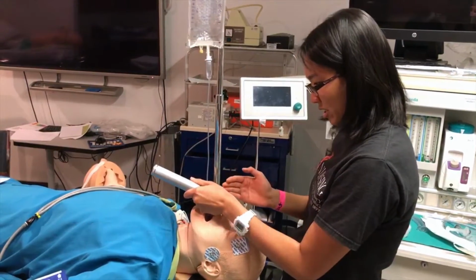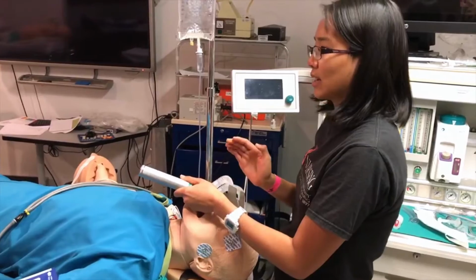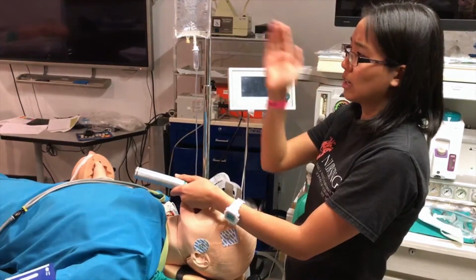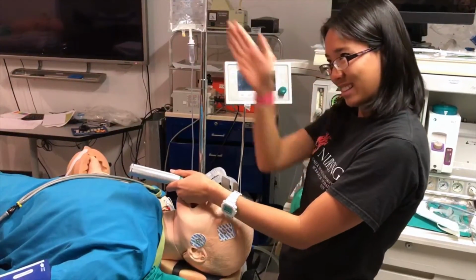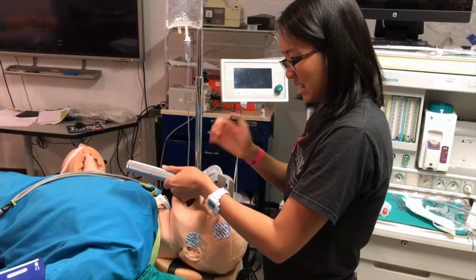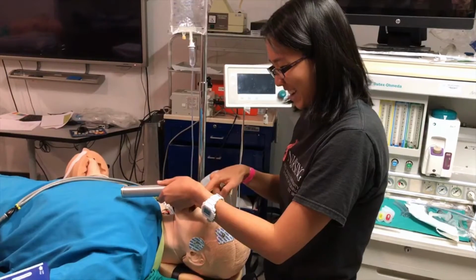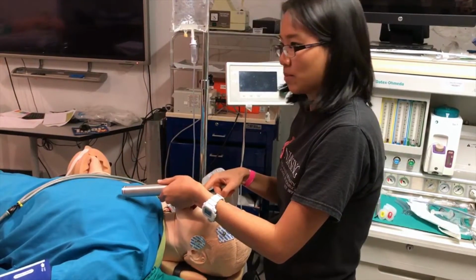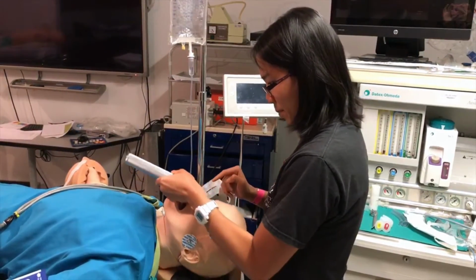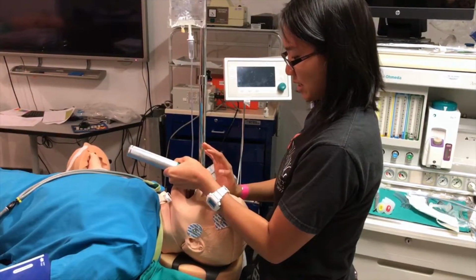When you are in the correct position, you want to keep your wrists in a neutral position and do an upward forward movement, so aim for the upper corner in the opposite side of the room, like this angle. If you rock back and do flexion, extension of your wrist, it can damage not the mannequin's teeth, but the patient's teeth. That's really bad. Dental damage can be one of the problems of intubation. So when you're in the correct place, you want to go up and forward. And then when you see the vocal cords, that's when we get ready to intubate.